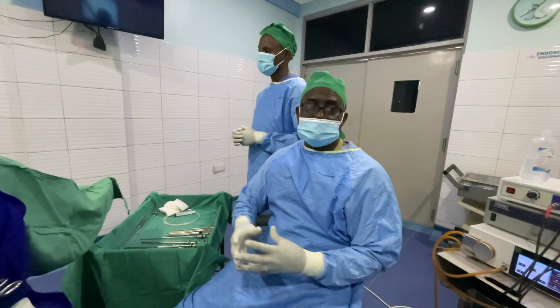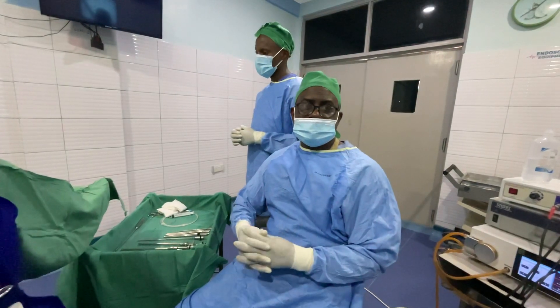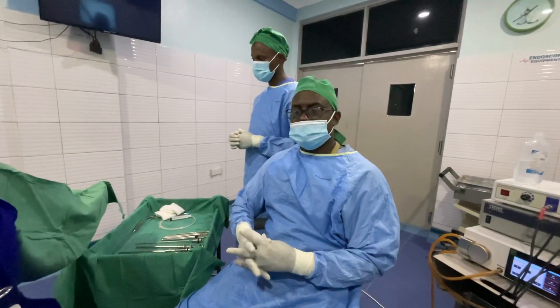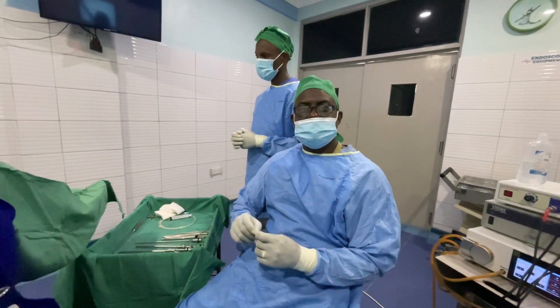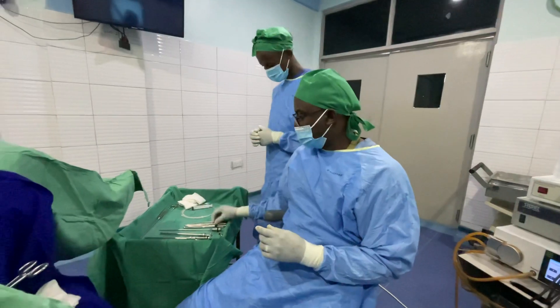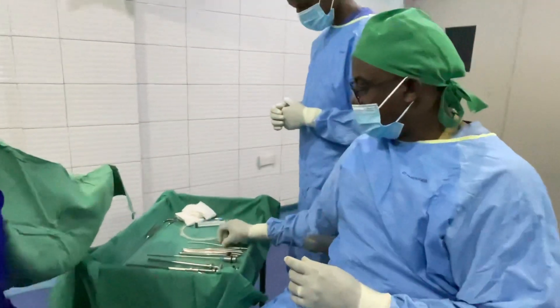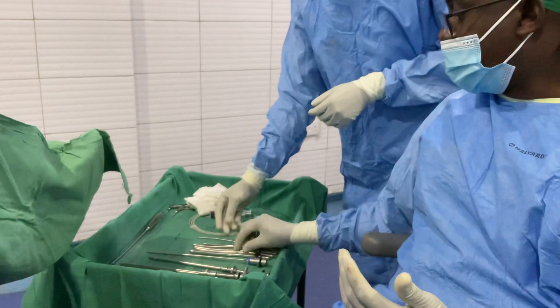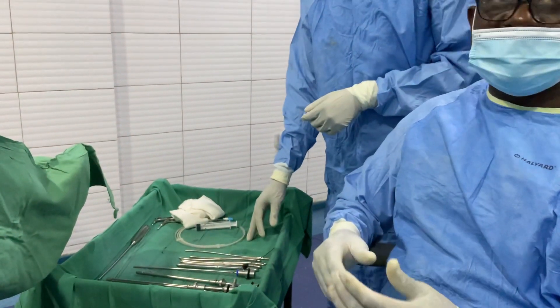If a woman has delivered some children it is usually a bit easier to dilate the cervix. On your trolley you should have Hegar dilators in different sizes because you are going to dilate the cervix depending on the need.